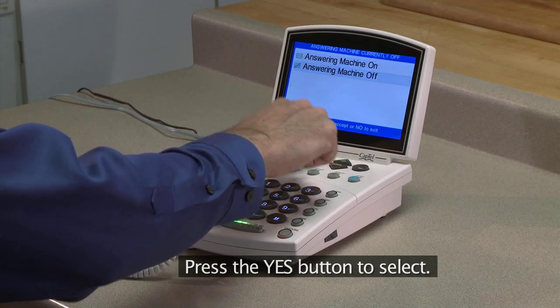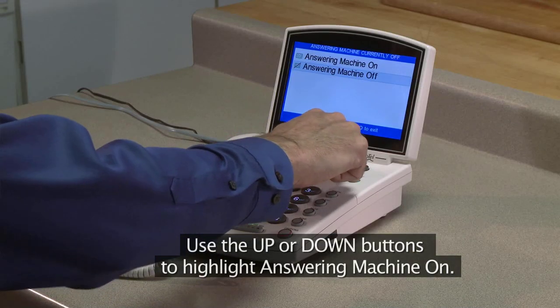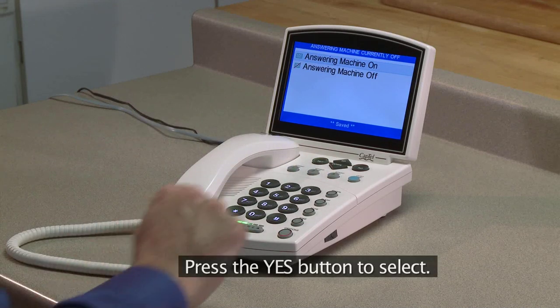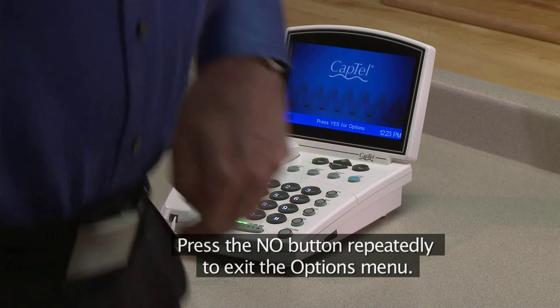Press the Yes button to select. Use the Up or Down buttons to highlight Answering Machine On. Press the Yes button to select. Press the No button repeatedly to exit the Options menu.